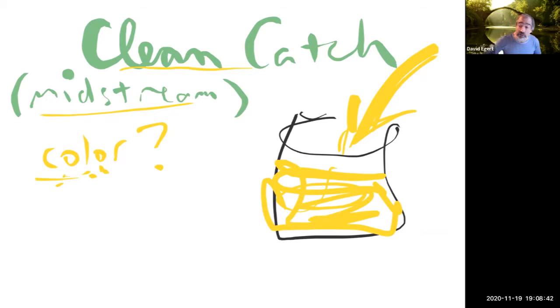Color, though, can also come from vitamins or stuff you're eating. If you've ever taken B vitamins, you get this fluorescent pee, or beets and other things can give you reddish pee. It can also be colored because of blood or something. So you do want to pay attention to the color. People who do this for a living have all sorts of words, I think straw or amber and so on. There are lots of classic words for how light or dark it is.